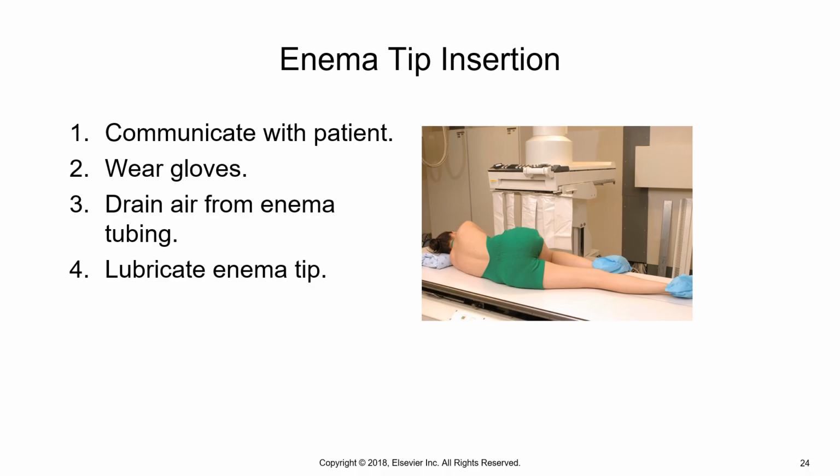When I used to do them, I did have a lidocaine gel that I would put on there as well, because a lot of your patients are going to have hemorrhoids. If they had them before, they're definitely going to be inflamed from their prep for this exam.